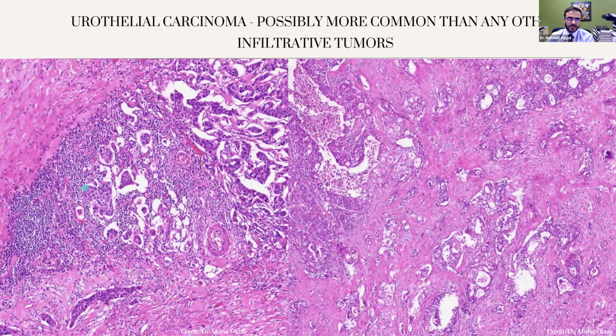Immunohistochemistry is important, and I like 3 immunohistochemical assays to confirm urothelial carcinoma: P63, GATA3, and keratin 7. This is another case in an elderly patient with a very large infiltrative mass. They were not sure whether this case was from renal parenchyma or renal pelvis. P63 was diffusely positive and GATA3 was diffusely positive. But we should be careful about Pax8. So when you have a renal mass, you automatically order Pax8.